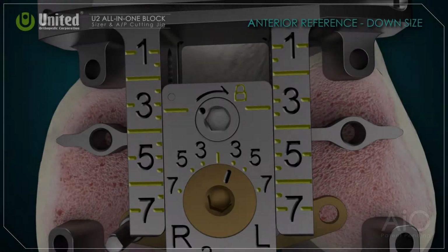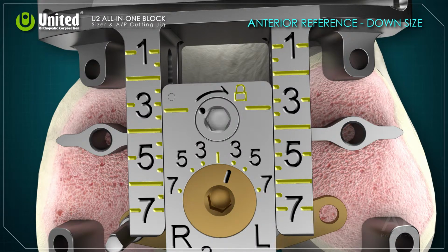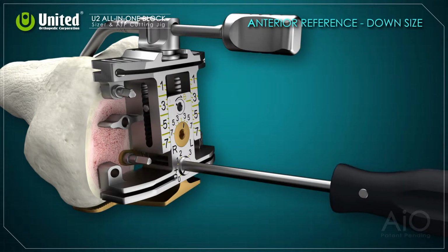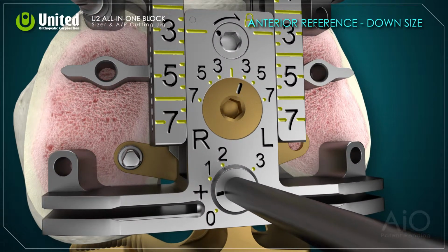In the anterior referencing system, if the size indicated is in between two standard sizes, like this case where the size is between 3 and 3.5, the operator may select the smaller one. With the anterior reference, the position of the anterior cutting slot will be fixed by a threaded pin. Then, elevate the posterior slot by adjusting the bottom knob to match the main scale size 3.